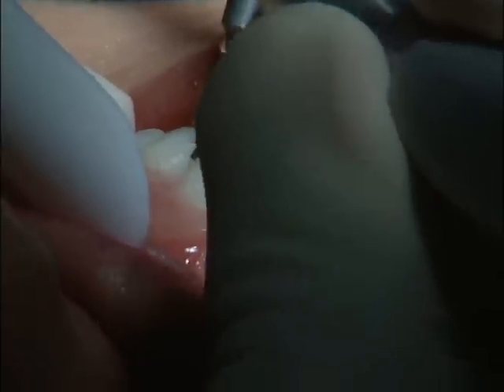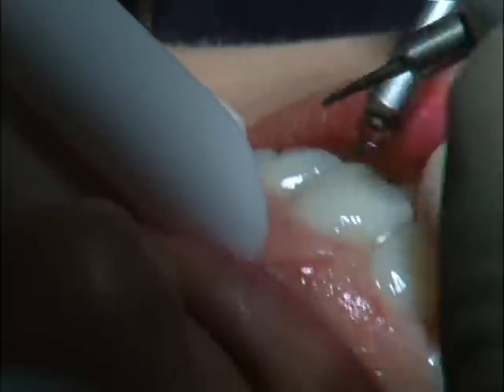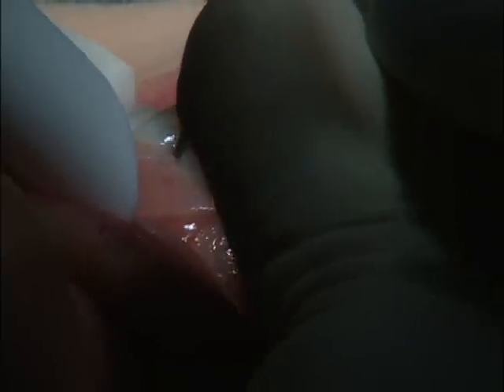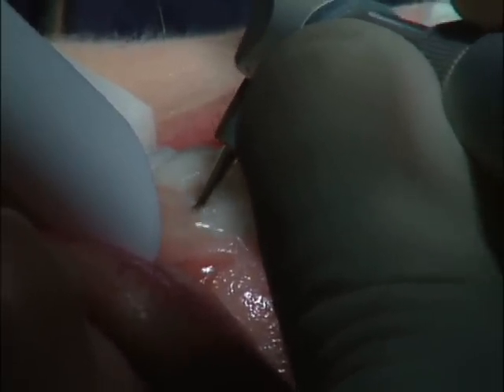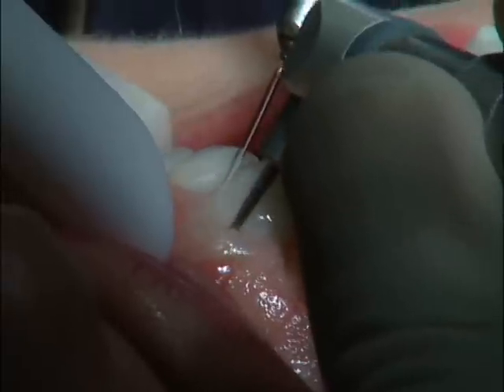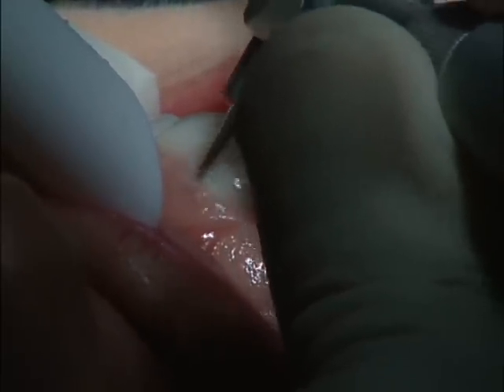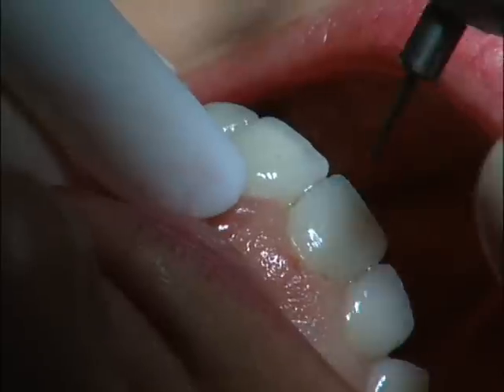What's that doing? They're just sterilizing the process. Can you see that little spot right there? I just want to make sure that if there's anything going on there, I'm going to take care of it — preventively. Just like what hygiene does.